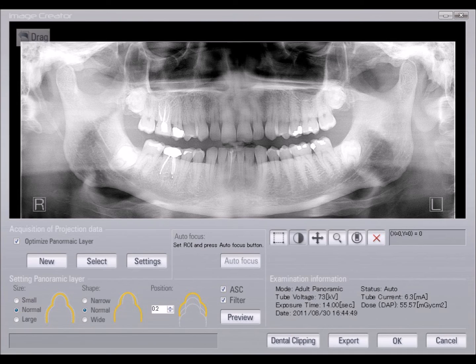When the scan is complete, the system will process and construct the image. During this time, you can ask the patient to step out of the machine. You'll see the finished acquired image appear on the screen, at which point you can click OK to transfer the image to the imaging software where it's permanently saved.